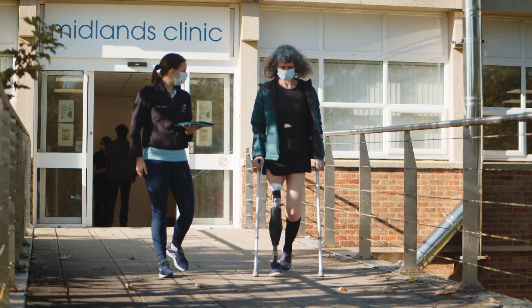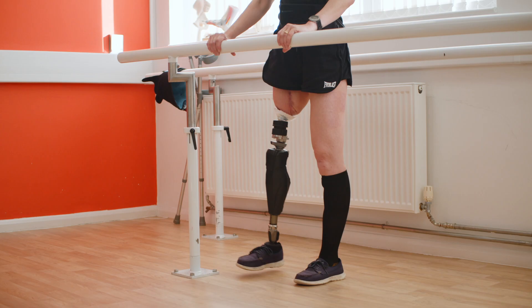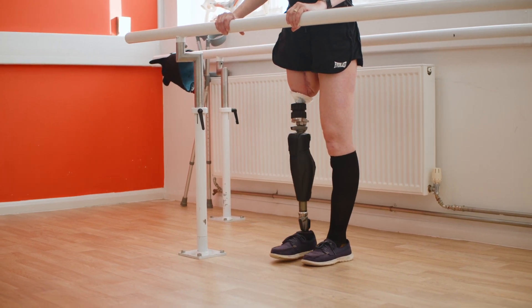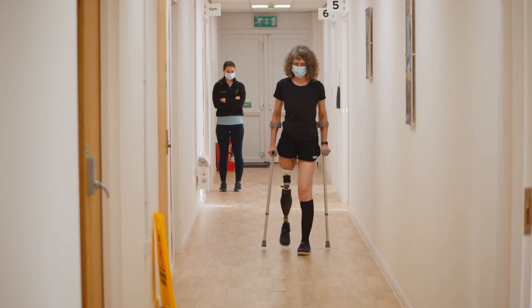That's with two crutches because we still want to offload that implant a little bit, but now we start to get forces from different angles. The titanium implant is porous and the bone is then going to grow into that implant. So the more directional forces we can get through that implant in a controlled way, the stronger that's going to become.